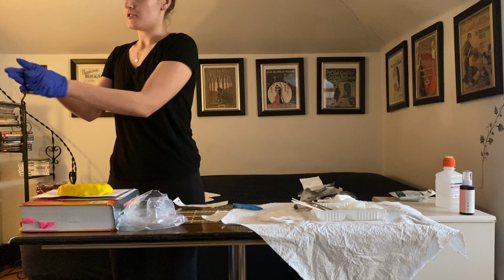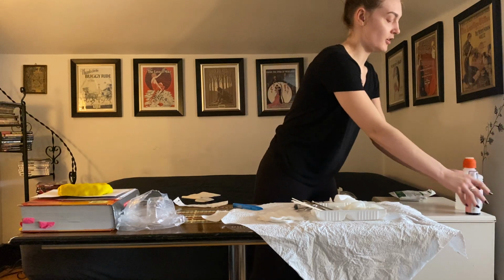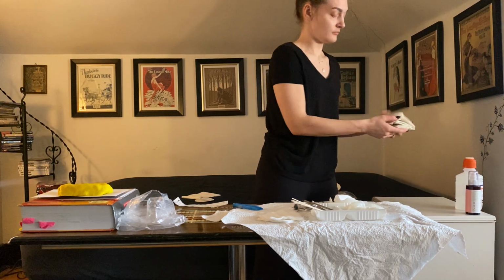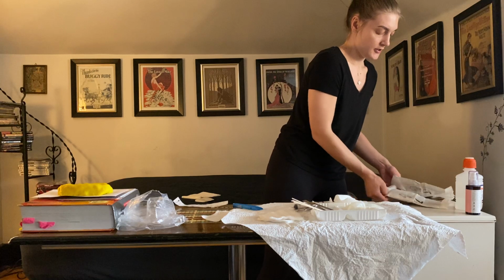And then I'm going to be disposing of the gloves as well, performing hand hygiene again. And then I'm going to be putting on my sterile gloves here. Just being very careful when I'm putting on the sterile gloves. And again, normally this would all be done at waist height.